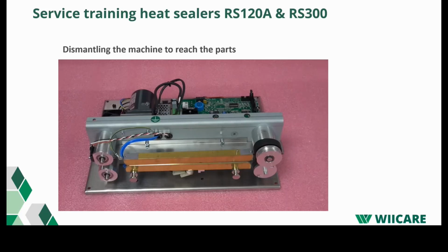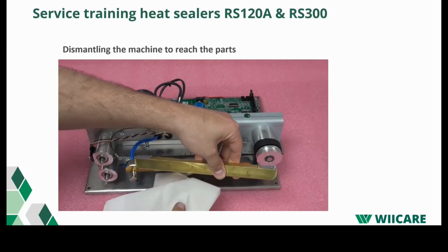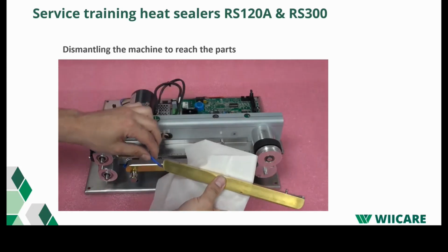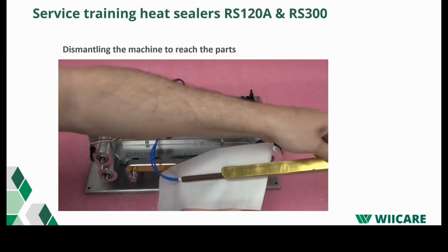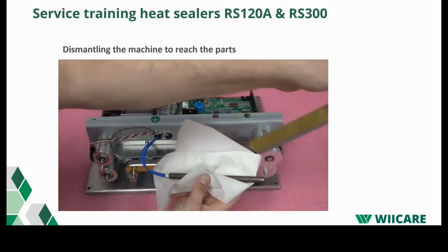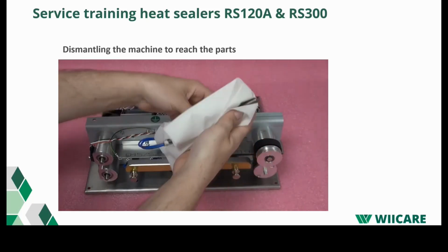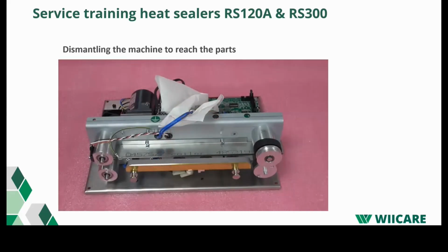Now you can take out the heating. You can put it in a paper towel to keep the sealer from getting dirty. It's always a little bit messy when you take the elements out because they are full of copper paste, which is necessary. So that's why they cover it just in a piece of paper.